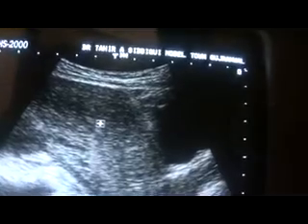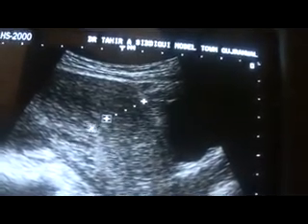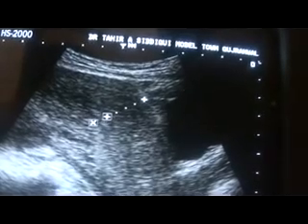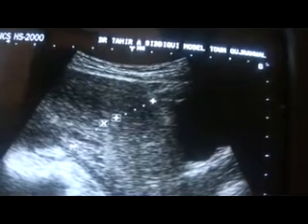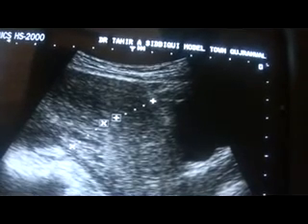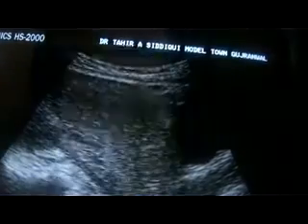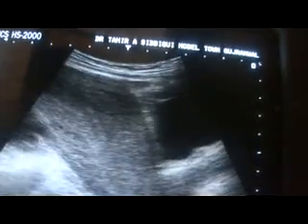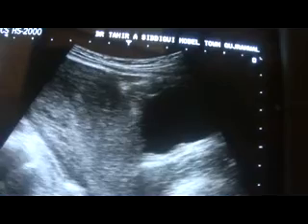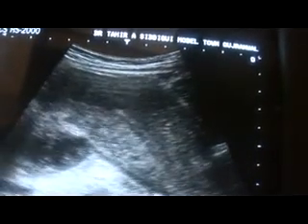In transverse section, this is the uterus, postpartum uterus, typical appearance of a postpartum uterus, magnified view with central clear endometrial canal, measuring 6.3 centimeters, normal for postpartum. This is the endometrial canal, the encircled area. This is the endometrial canal, and there is nothing significant.